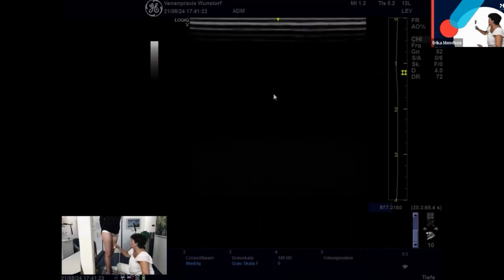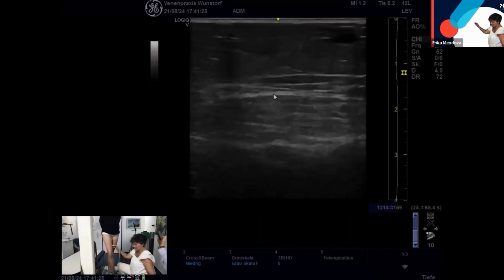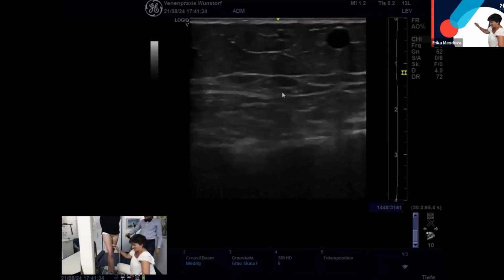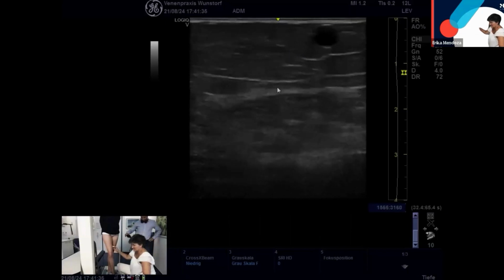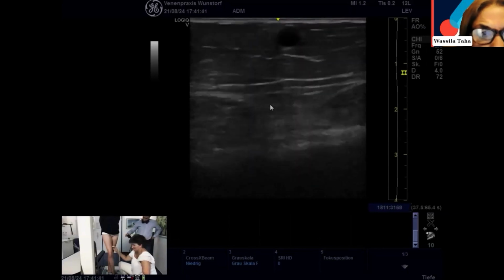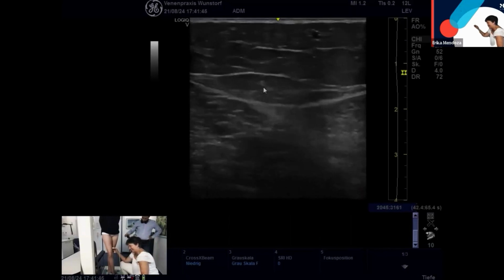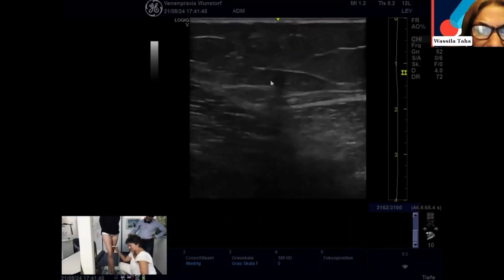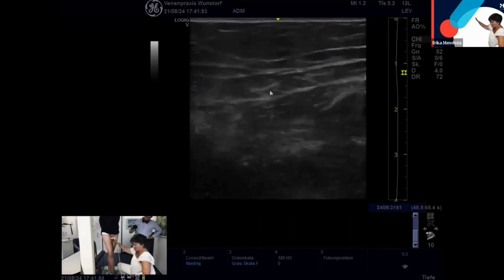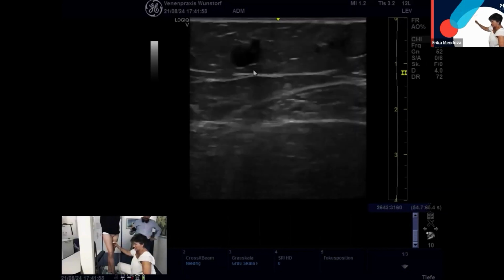Here we go to another place. If you go to the inner thigh, here is the subcutaneous area, but there is no vein inside. So there is no saphenous vein, but we have a superficial vein, a superficial access. Just ignore it for a second. Under the skin we can see the vein. We just want to check how well the vein stripping worked. So now we go down the path where the vein was stripped and we find the vein here.